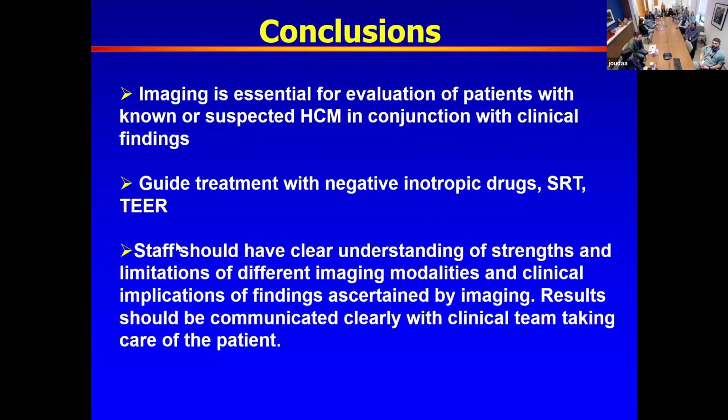Thank you. So, but how quickly actually do you have to acquire it, and how quickly does the gradient actually drop? That's another discussion. So it's a good point. I do not know how quick it drops. That's the concern, of course. Odds are high it doesn't drop that fast.